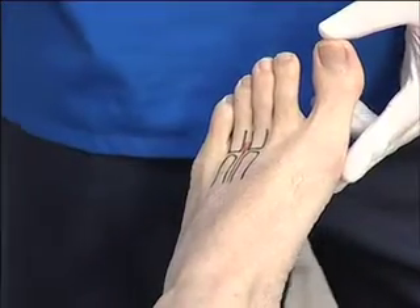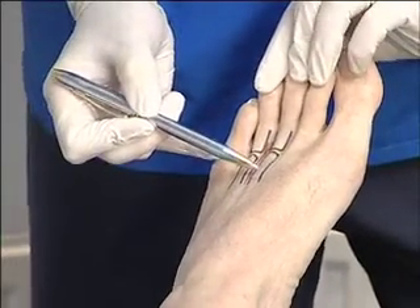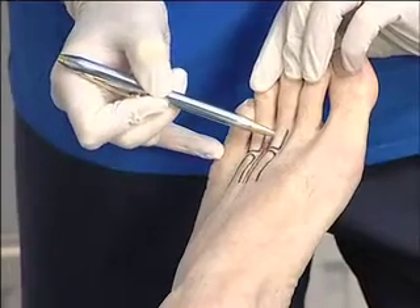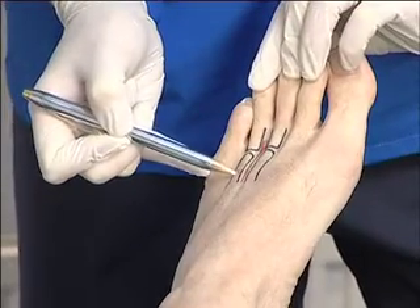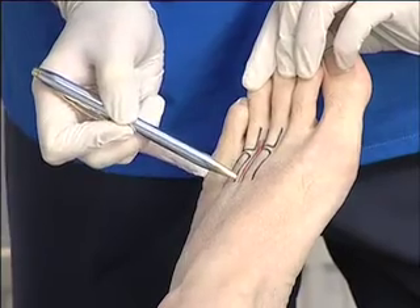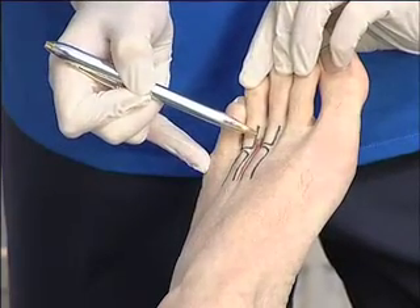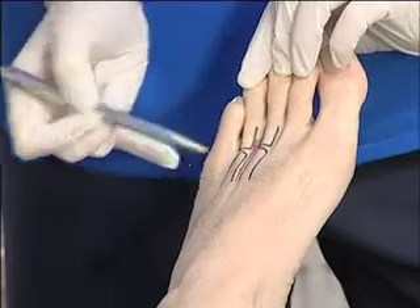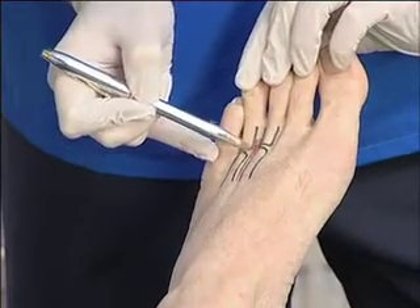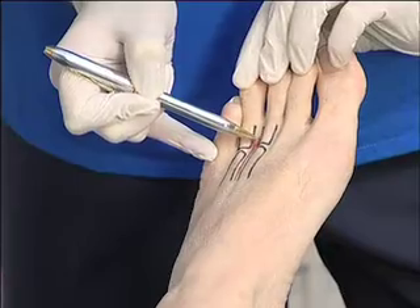For the injection of Morton's neuroma, I've marked up some anatomy — the third metatarsal and proximal phalanx, the fourth metatarsal and proximal phalanx — and marked in red where the nerve would be. Remember that it is a plantar nerve that gets trapped, and typically the entrapment is not between the heads of the metatarsals; it is somewhat more distally.